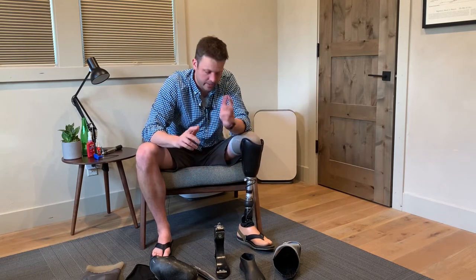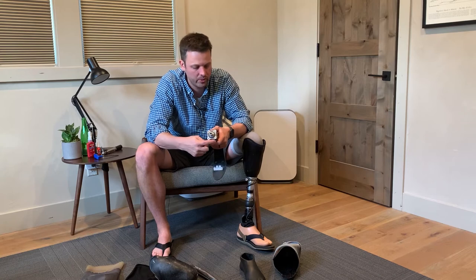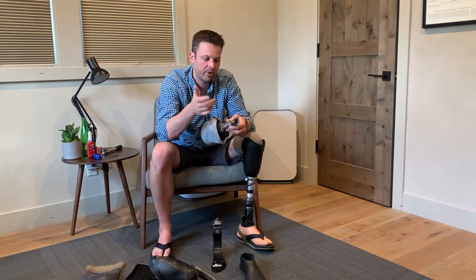If you're on vacation and going back to the beach the next day you've got to put it all back together. If you live at the beach, you might want a foot you truly don't mind beating up that can handle it without worry about rust. Every foot and leg part I've seen — all the screws and set screws — they are not stainless steel, so they corrode very easily.